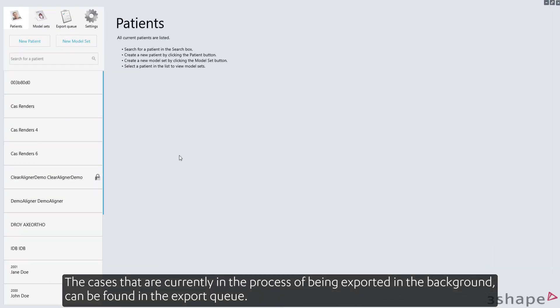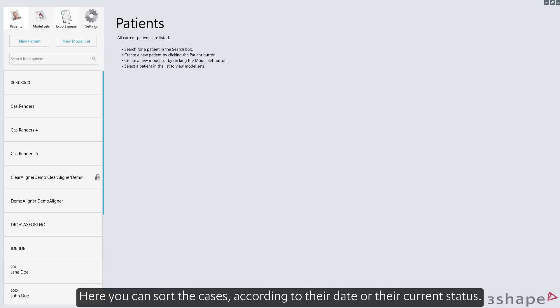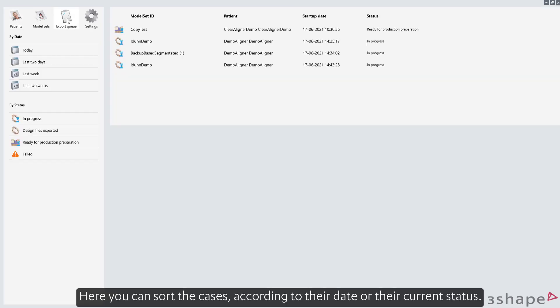The cases that are currently in the process of being exported in the background can be found in the export queue. Here you can sort the cases according to their date or their current status.